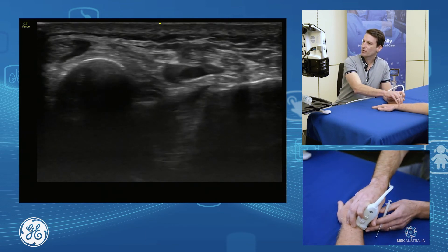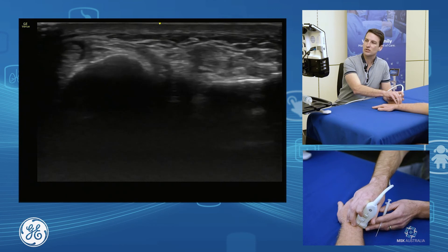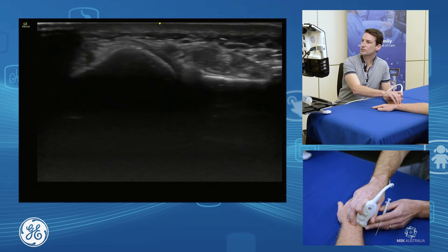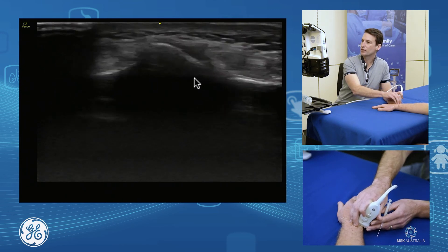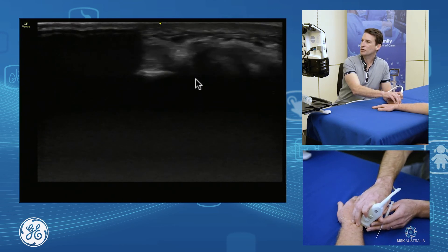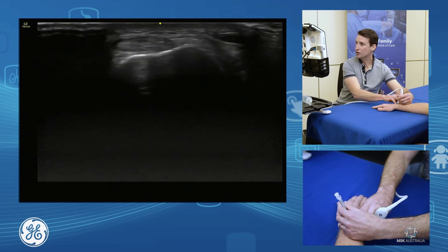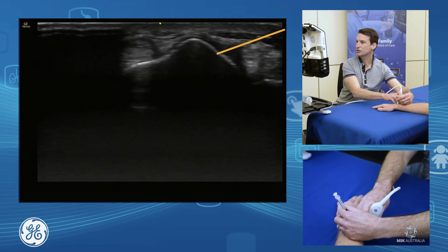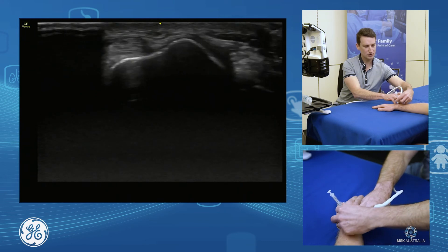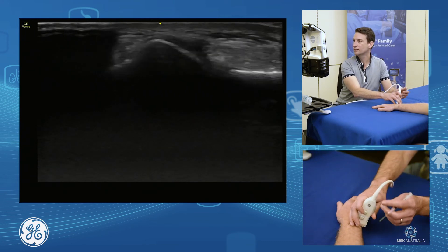For our distal radioulnar joint injection, we again use radius and ulna, sliding down until we come to that joint line, moving across, and we can simply drop down onto the cartilage and inject. Just a simple approach down onto the cartilage there.